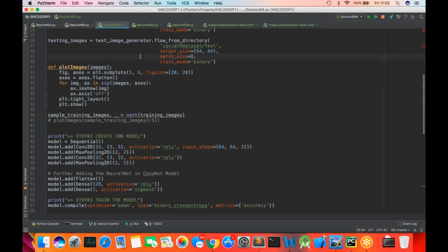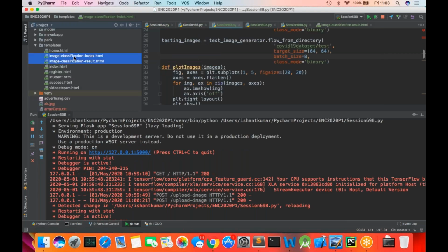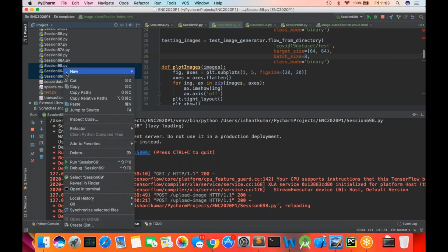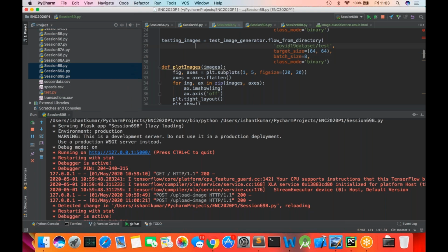A CNN model, image classification from 0 till how we can write an app, and saving the model and reusing the model. So this is all for the day, guys, and now I expect that you guys would have kind of created some interest, and you would be able to sort of solve the problem statements in the real-time environment.